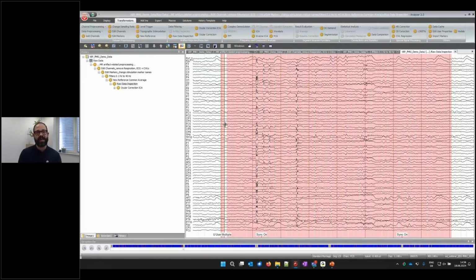You could drop them later when you cut your signal down into trials. However, other steps like our next one to come, the ocular correction ICA, or also the normal ICA that we have in Analyzer, or the ocular correction based on regression, and also average, will ignore those intervals in order to avoid introducing contaminated data into your analysis.